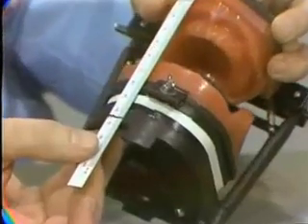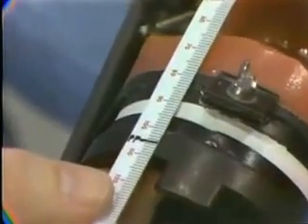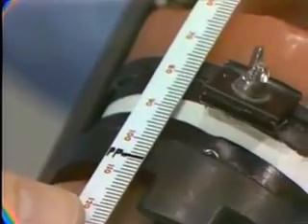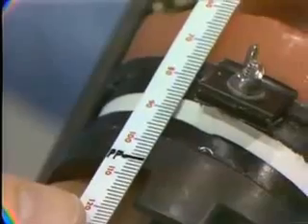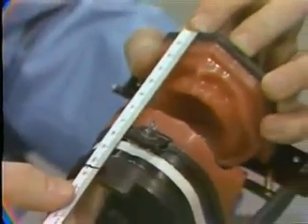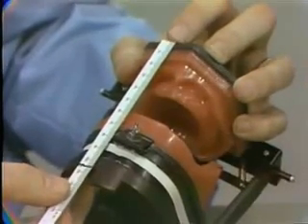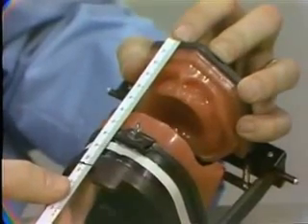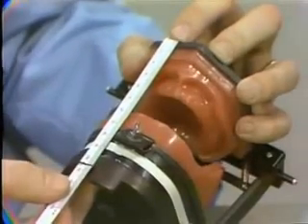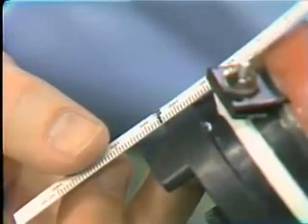and have drawn a line, around 105, which I'm calling postural position. In other words, measure from the top of the articulator, and I want you all to measure from the same point on your instrument, from the top of the articulator, flush with the top, to this area on the bottom rim of the articulator, or really we should call this the patient. 105 millimeters we would say would be, say, postural position.